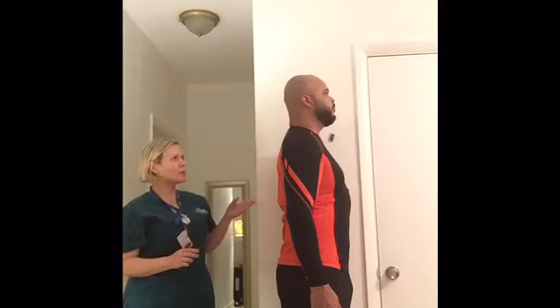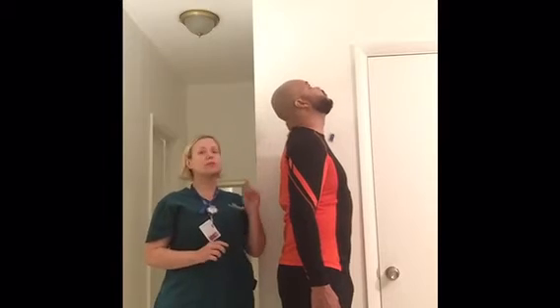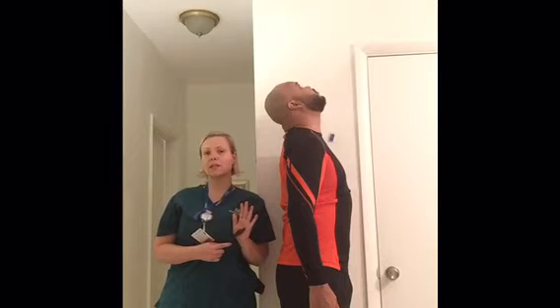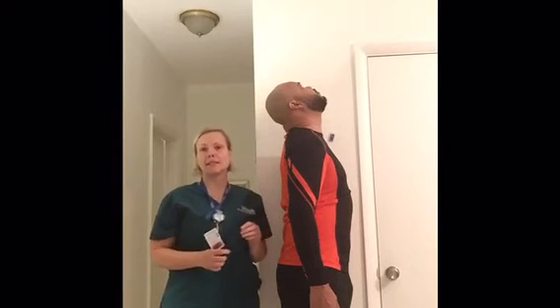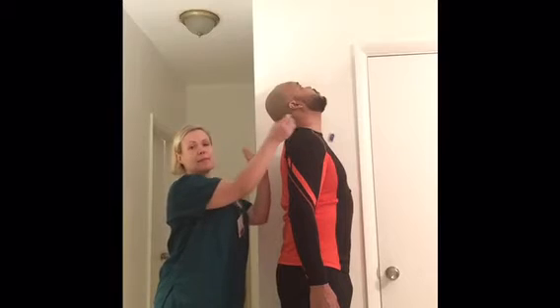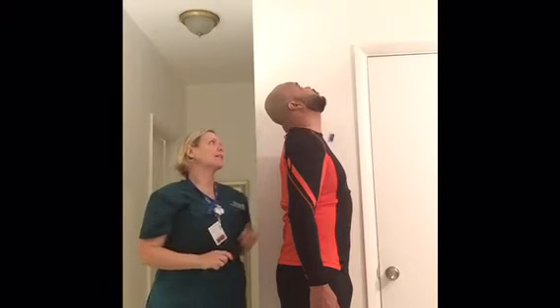We want to ask the patient, if you can, please look up as much as possible, please look up to the roof. It will also be perpendicular, centered to C4, and the patient has to be centered at the middle, so the cervical has to be at the middle of the IR. And you can relax your head.